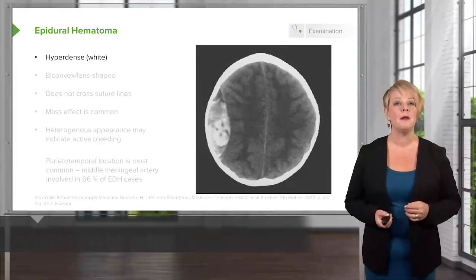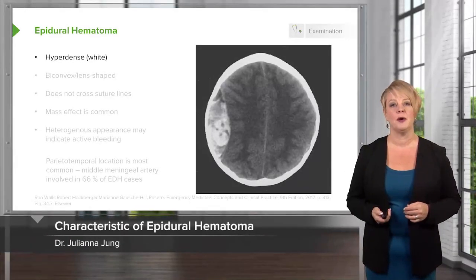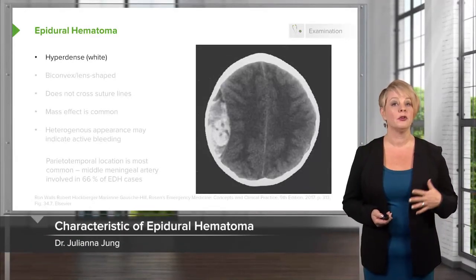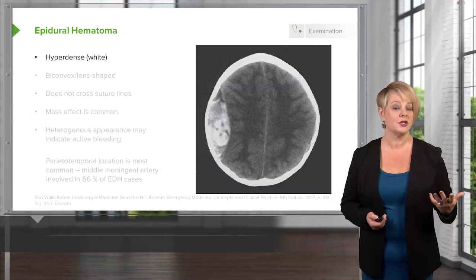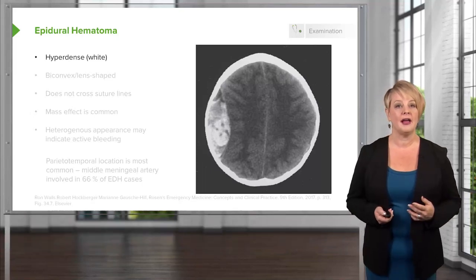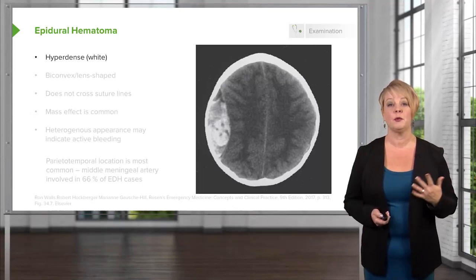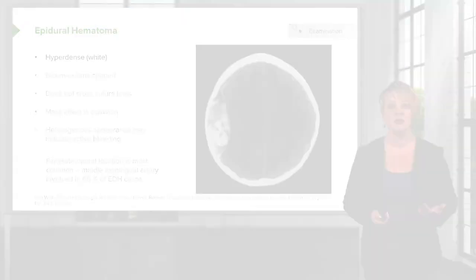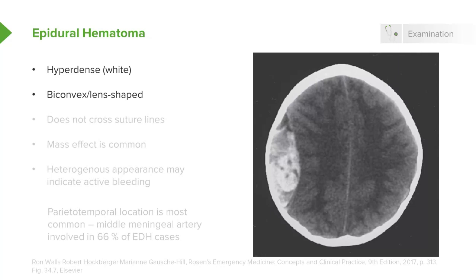Here's an example of an epidural hematoma. You can see that there is a large collection of blood on the right side of the brain, and it's hyperdense, so it's white. It's biconvex or lens-shaped, which is very characteristic of an epidural hematoma.